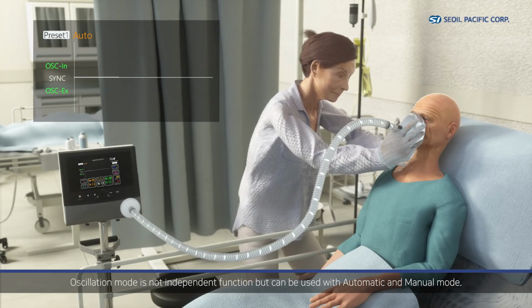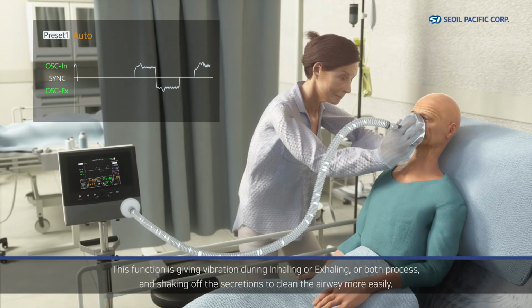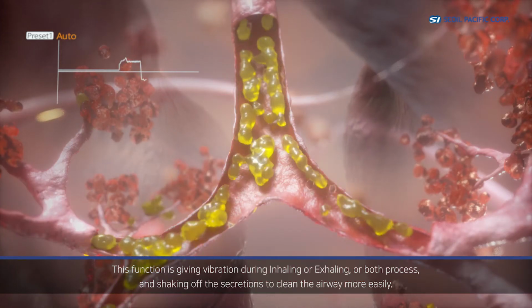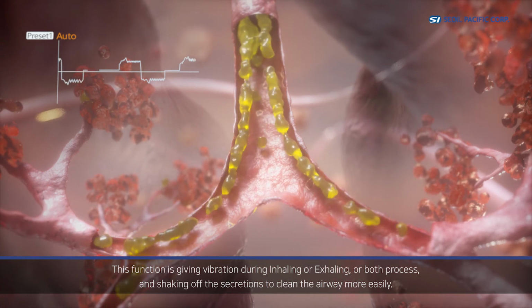Oscillation mode is not an independent function, but can be used with automatic and manual mode. This function gives vibration during inhaling or exhaling, or both processes, shaking off the secretions to clean the airway more easily.